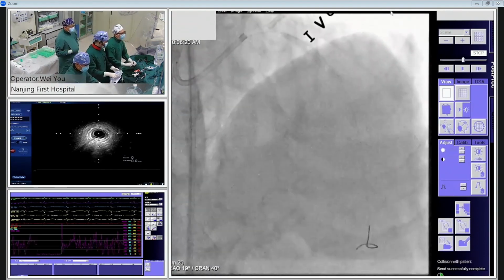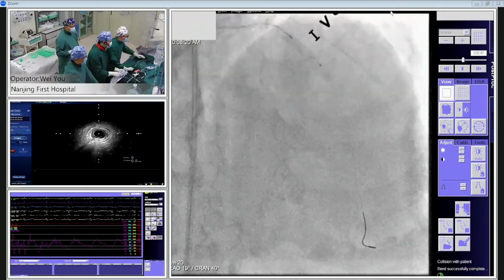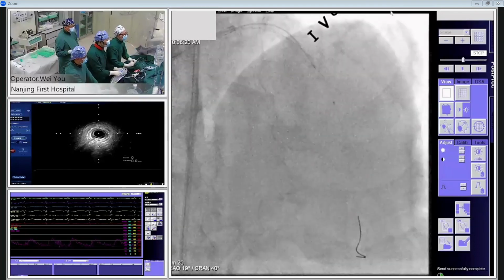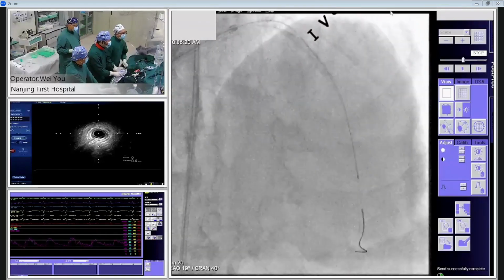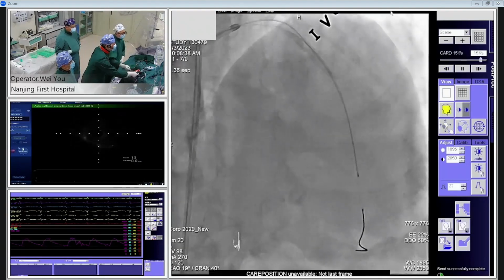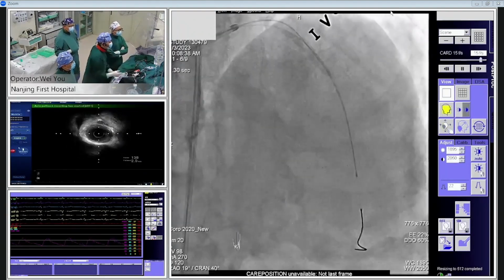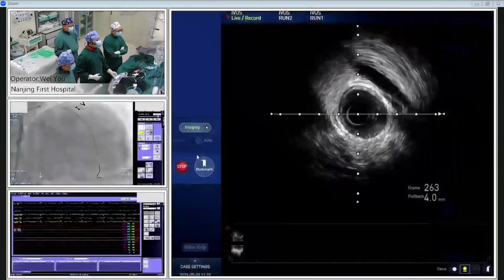So it's a SLAM super support wire. Yeah, very nice. Very good. Okay, I think it's enough because distal we did not touch. Okay, so we can go to more proximal. I will refer back for the distal LAD. No more. It's a normal segment.